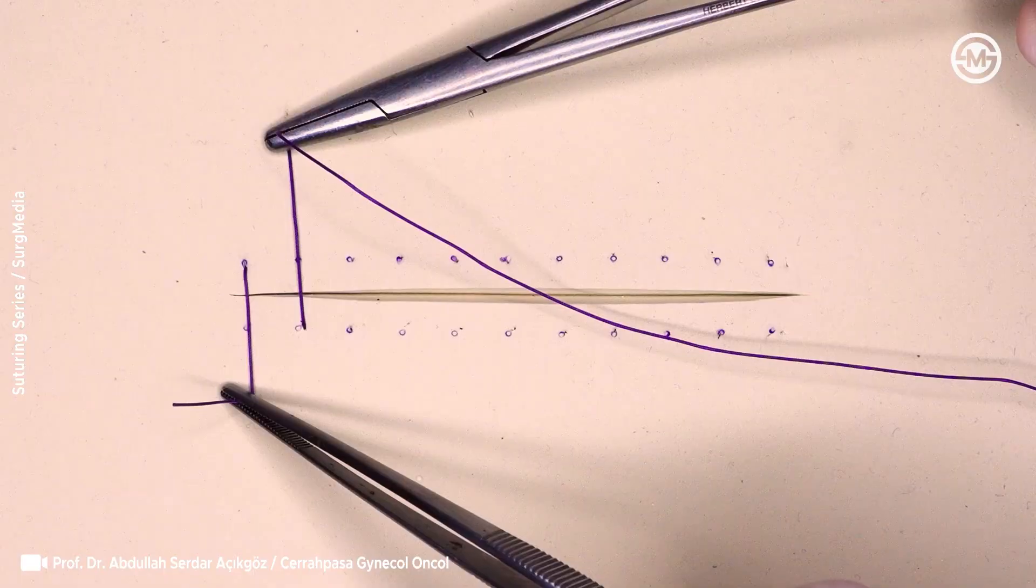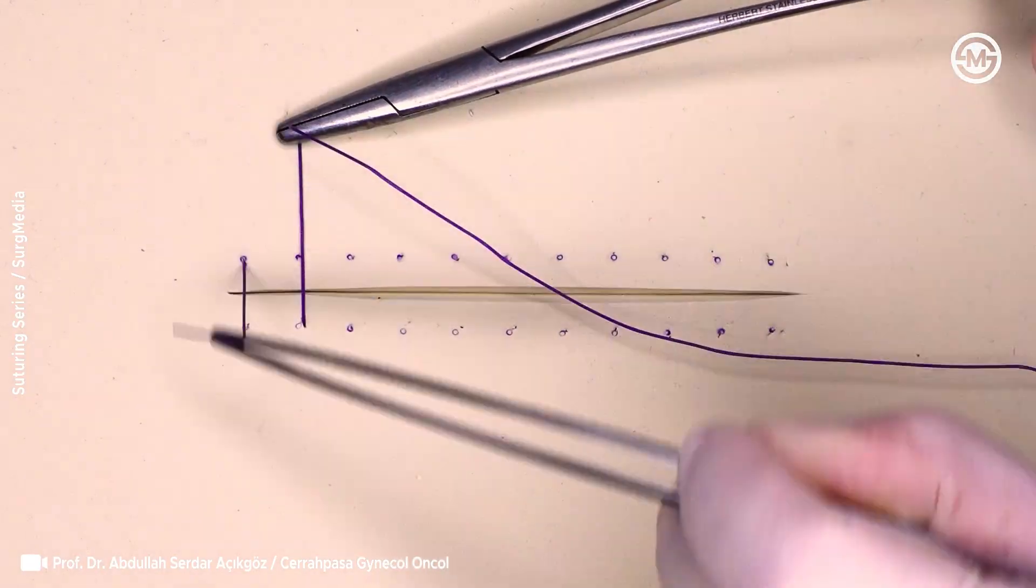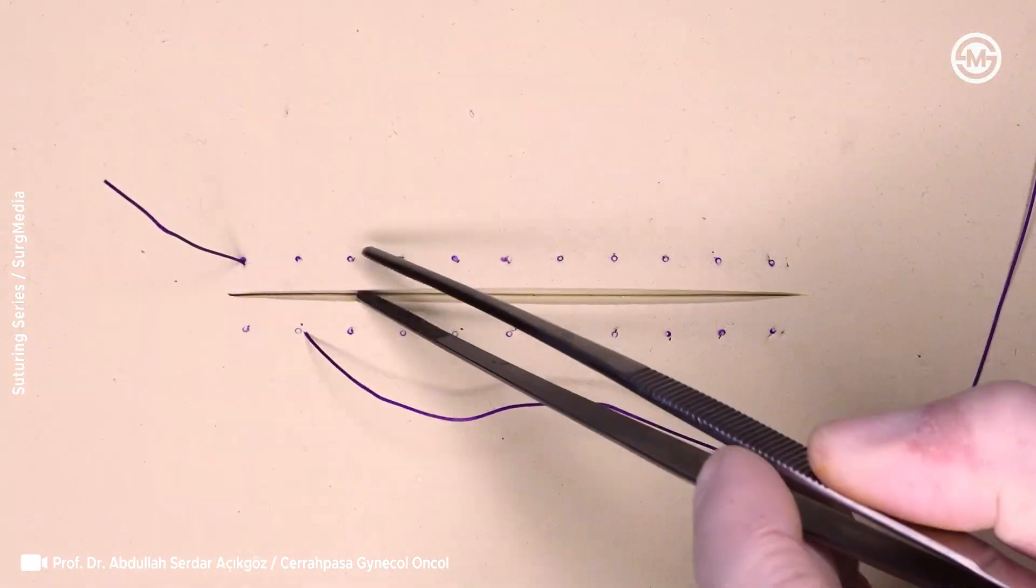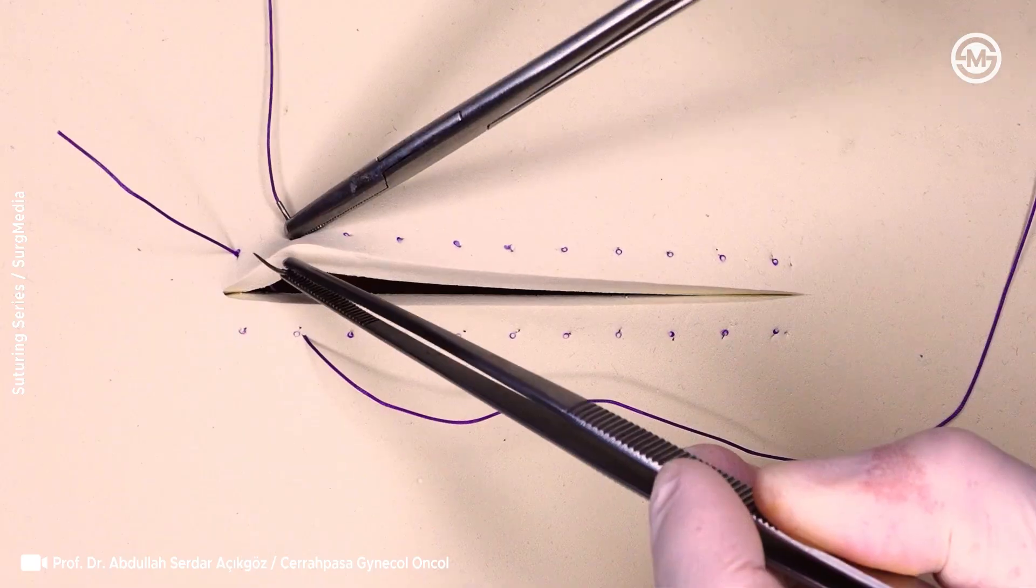When you look at it from the outside, you'll see two parallel suture lines, but underneath, inside the tissue, it creates a familiar crossed pattern.